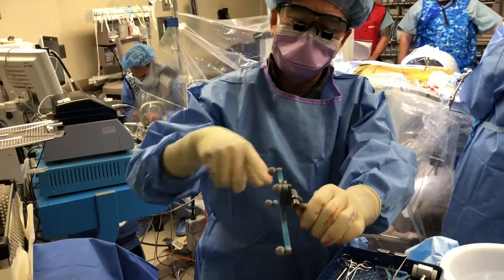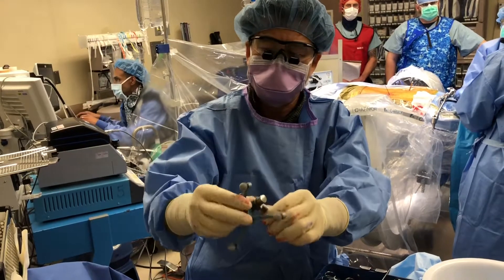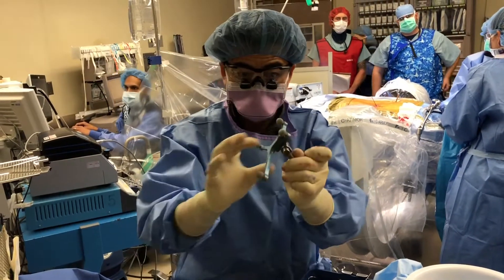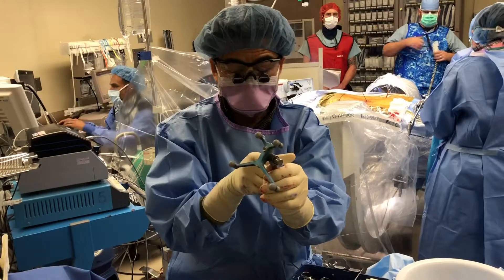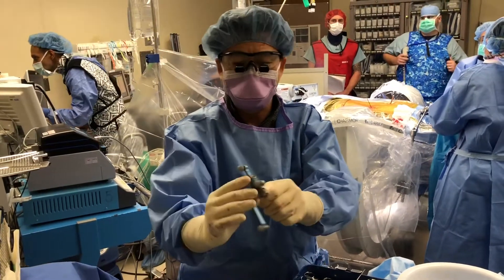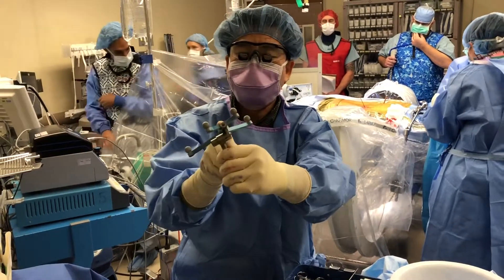You want to make sure that when you do the spin, those teeth are properly aligned, because what can happen is it can be perched up, and we may not realize it. A tiny little touch will let it click into place, and if you don't appreciate that change, you'll get a navigation image that's slightly off, and at some point during surgery, with very minimal touching, it will pop back into place.